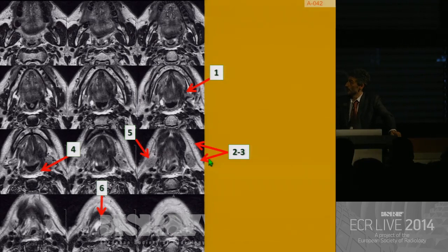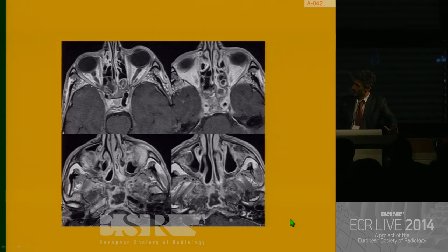Then, normally, you also will see thickening of the platysma and non-homogeneity and reticulation of the subcutaneous fat tissue. You may have variable degrees of atrophy of the submandibular glands and edema in the retropharyngeal space as well as in the supraglottis. This is quite a typical appearance after radiation therapy, and once you know what is the normal picture after RT, you may understand more easily what is not a normal expected image.